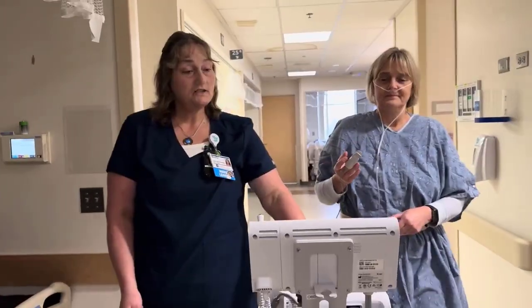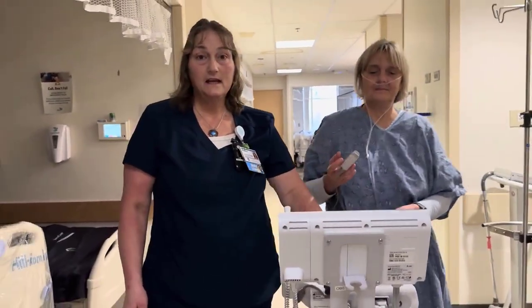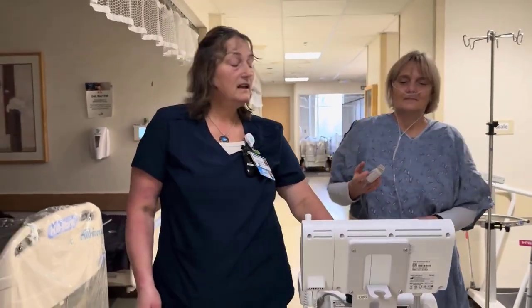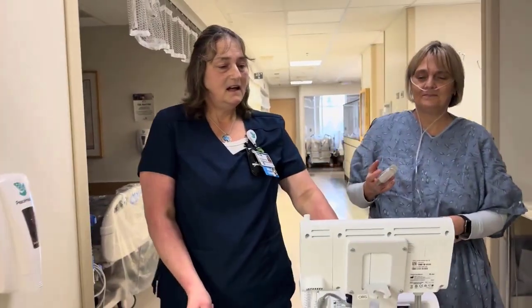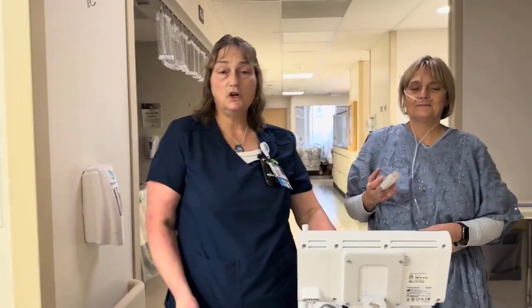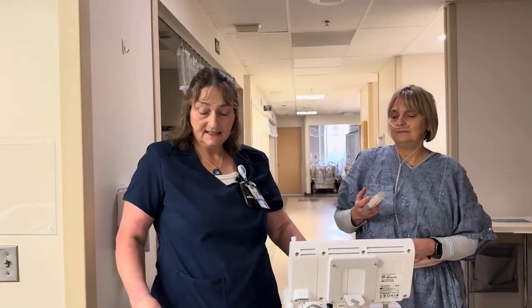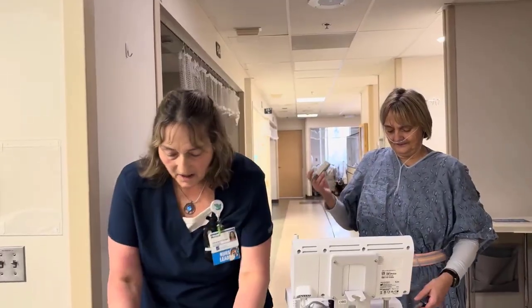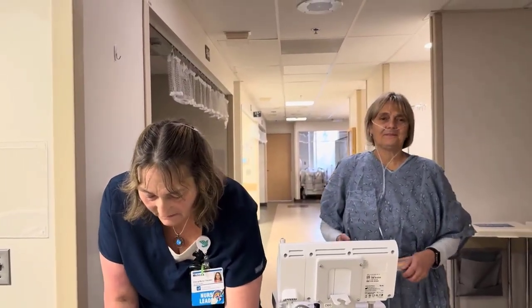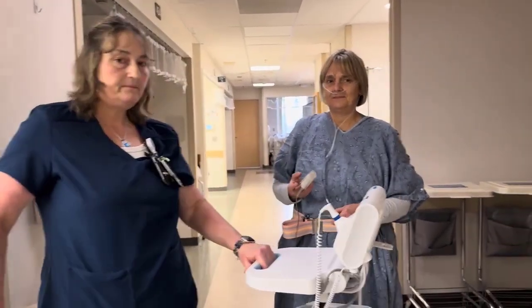Okay, so I see her oxygenation is falling a little bit. She's down to about 89%. Okay, you doing okay? Yeah. Good. Okay, so she is now below 88%. She's down to 87 and even 86. So we're going to pause. I'm going to put you back on the oxygen. Plug you back in. And again, I'm going to turn her to 1 liter. We're going to pause and see how she does on 1 liter. Let's go ahead and turn around and go back.